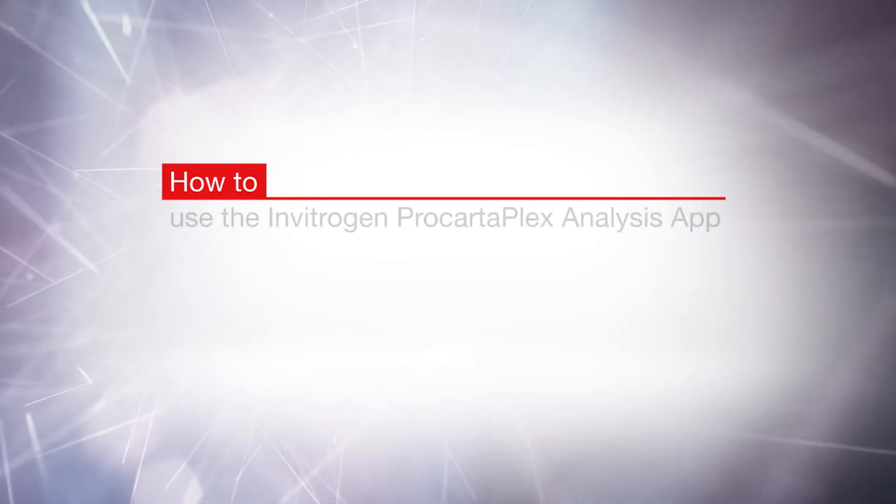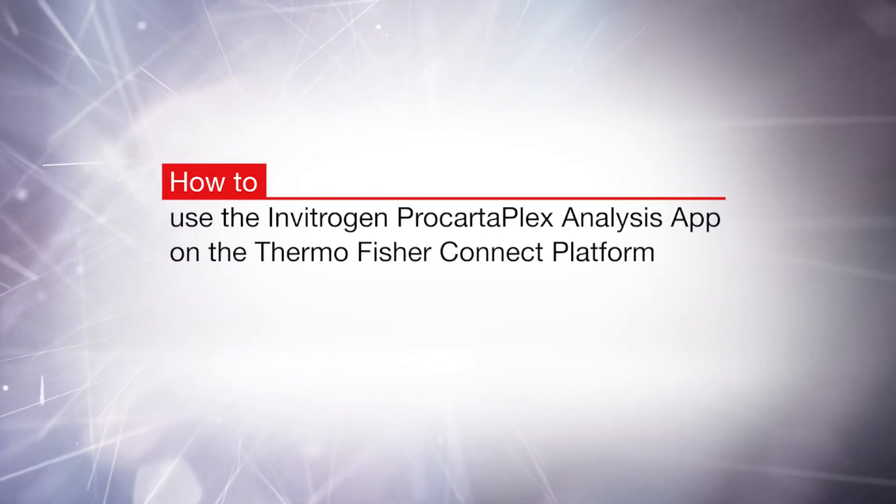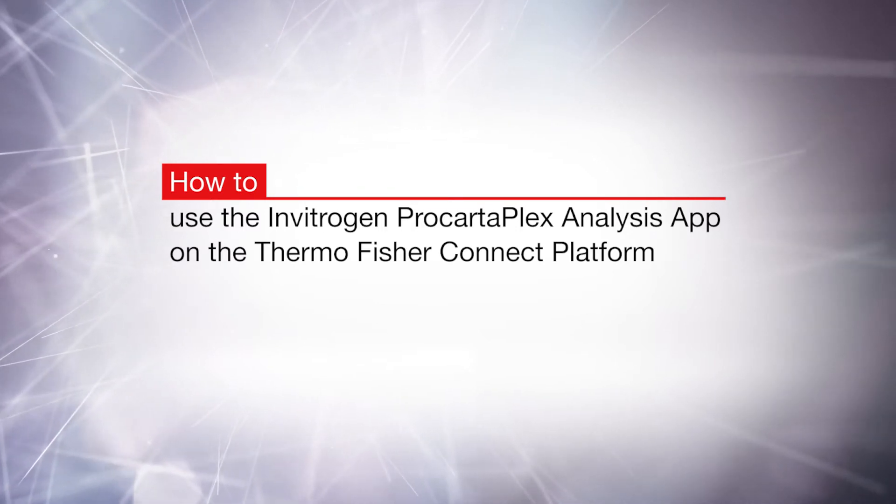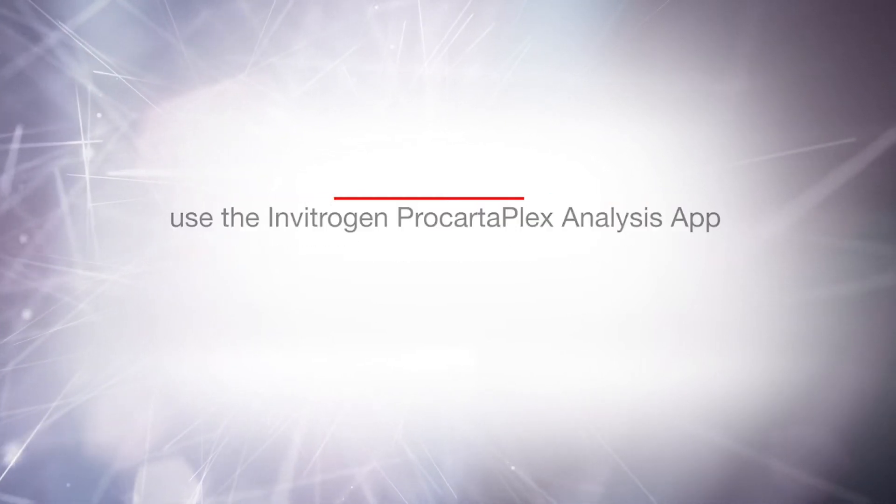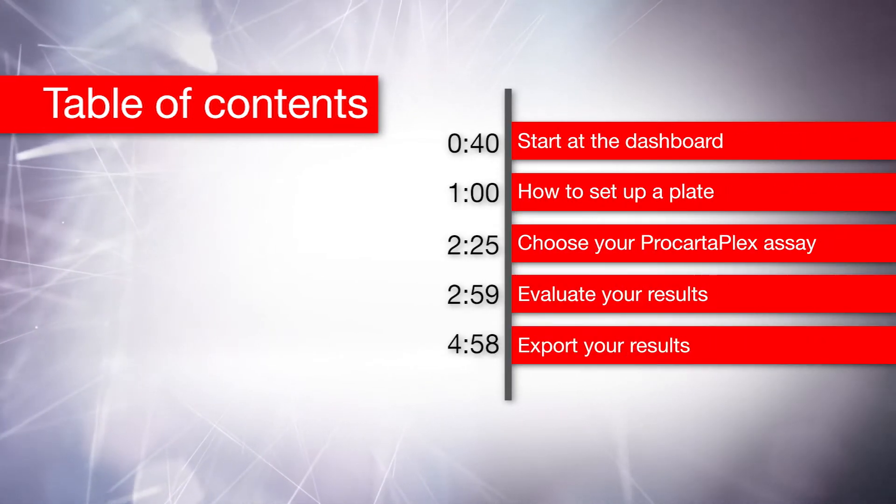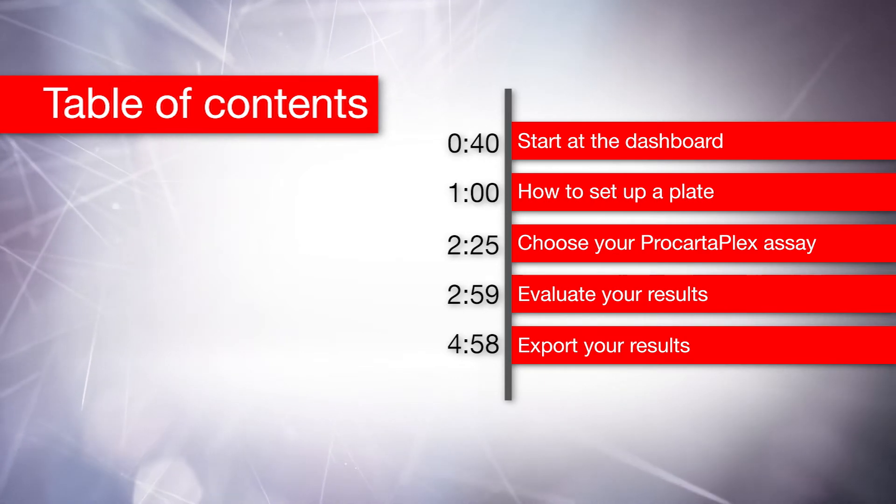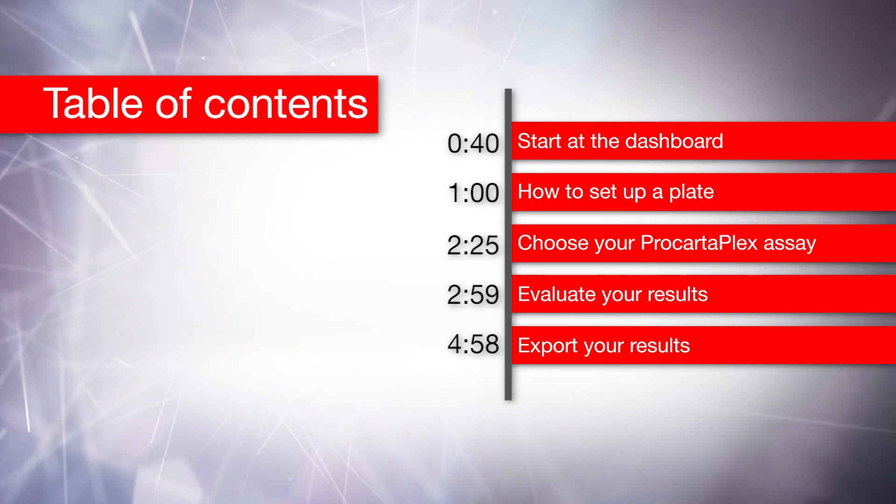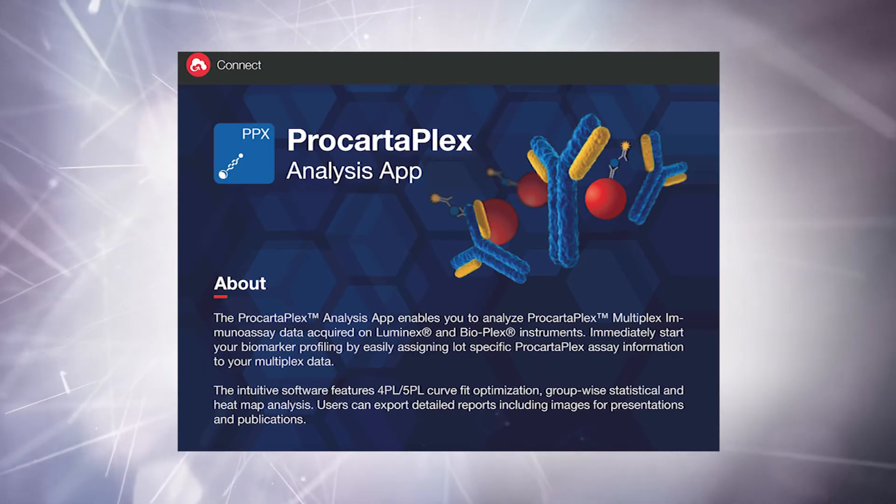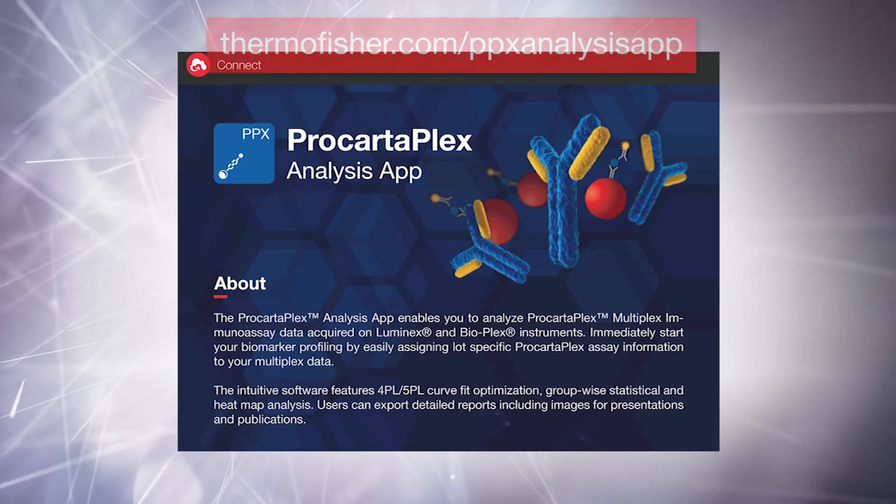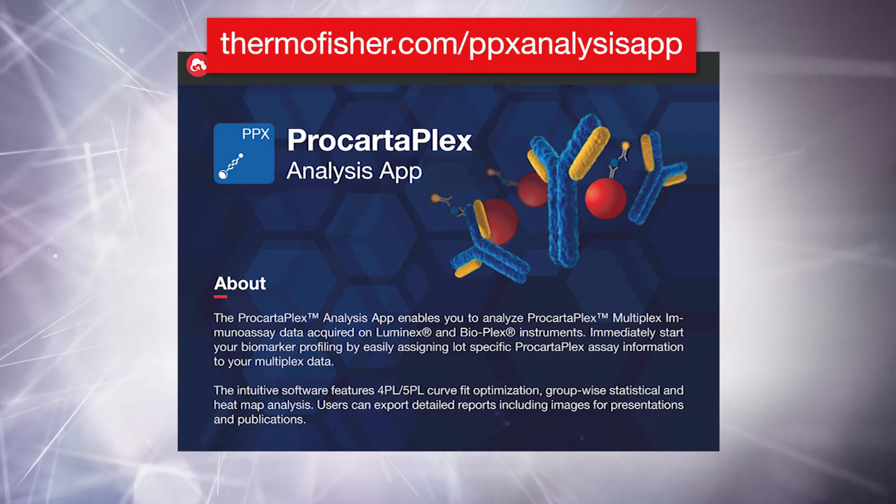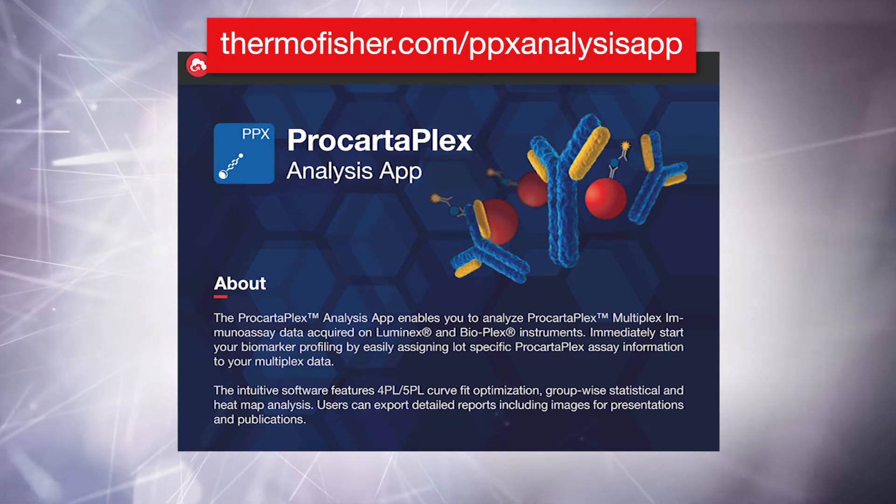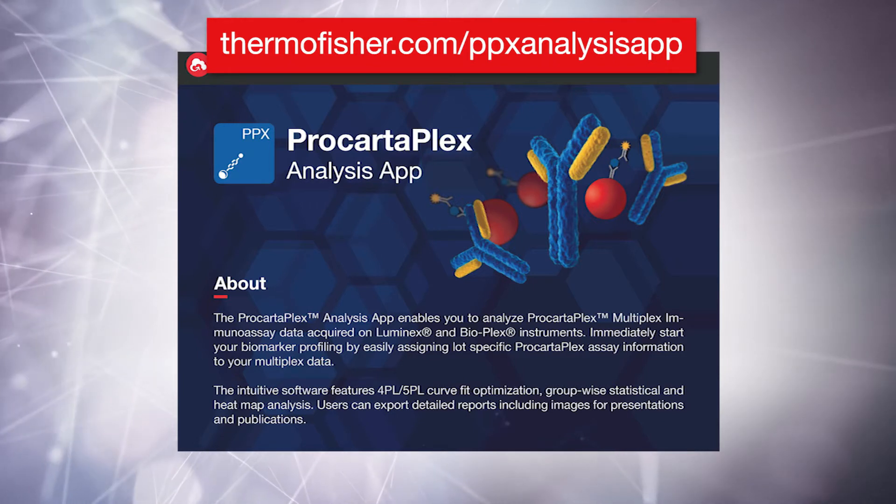In this video, we will show you how to use the ProCartaPlex analysis app available on Thermo Fisher Connect. This cloud-based software app is offered free of charge to all ProCartaPlex customers. All you have to do is sign up for an account at ThermoFisher.com. Use the link shown.